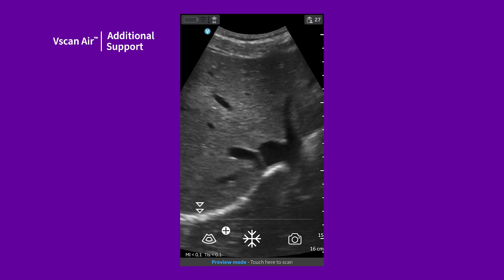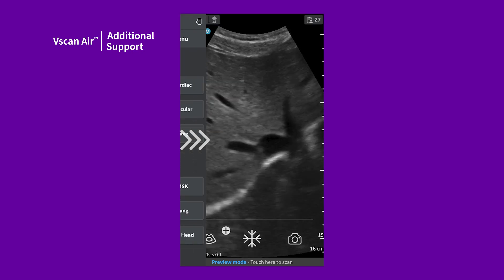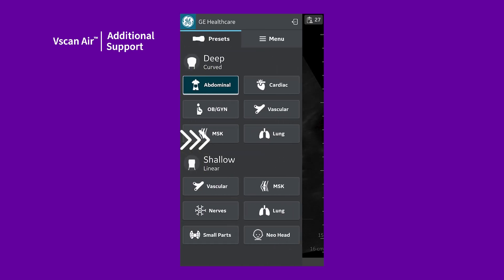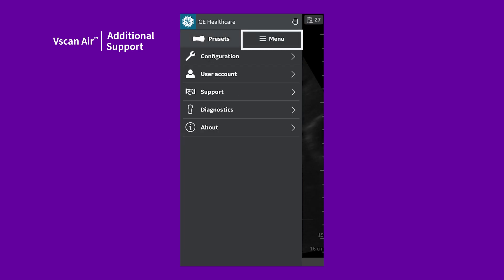Need additional help with vScanAir? Swipe to the right, tap Menu, and tap Support.